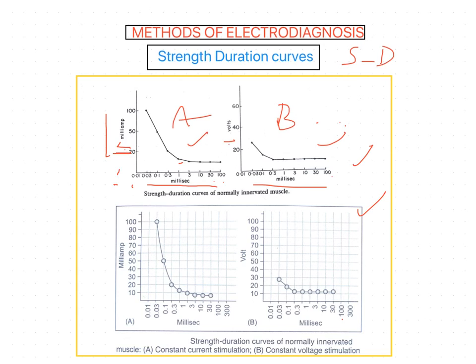The patient must be sitting, fully supported, and in good light. We have to use an indifferent electrode, which may be applied to some convenient area, usually on the midline of the body or over the origin of the muscle group, and the active electrode over the fleshy part of the muscle.